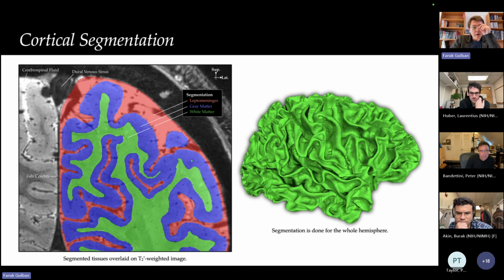So by taking our cue from Duvernoy's surgical methods to extract the brain and highlight the vessels, I basically tweaked the usual brain extraction and segmentation algorithms a bit to get the following segmentation. So I have first the leptomeninges tissue that is basically following Duvernoy, that doesn't include the dura mater, but everything below it inside.